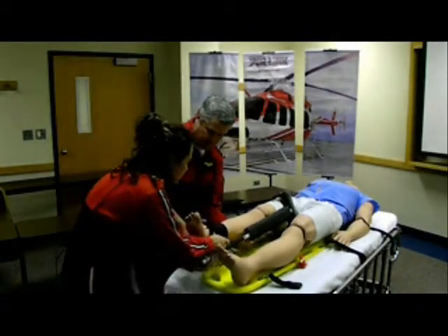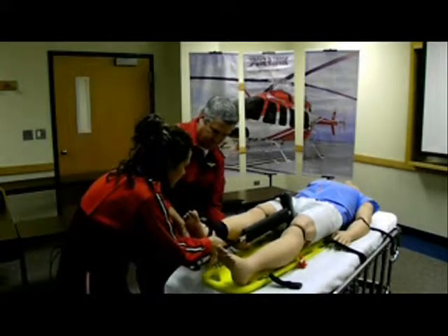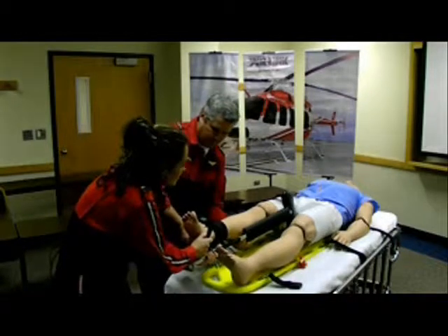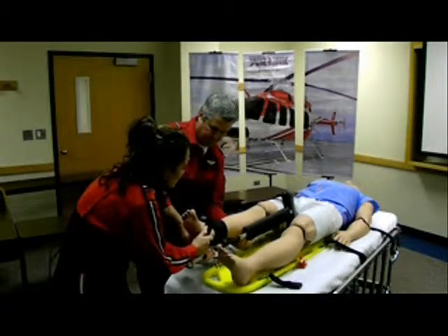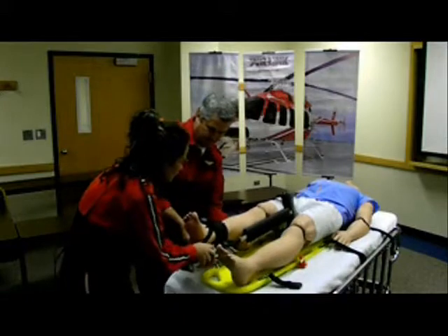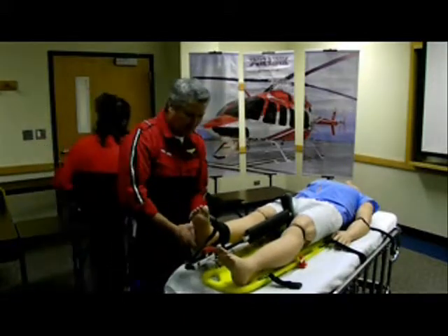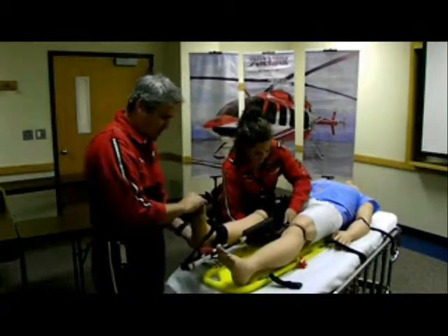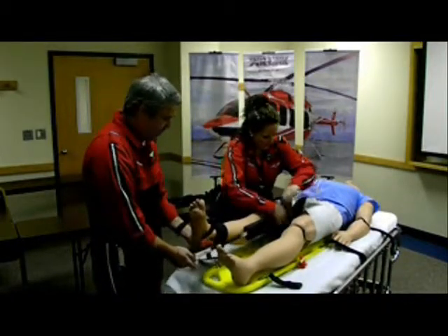Traction is going to be about 10% of the patient's body weight, not to exceed 22 to 25 pounds. You'll see the patients have a relief in pain with administration of the traction. Once traction's been applied, maintain manual stabilization and reassess for pulses, capillary refill, distal sensory.